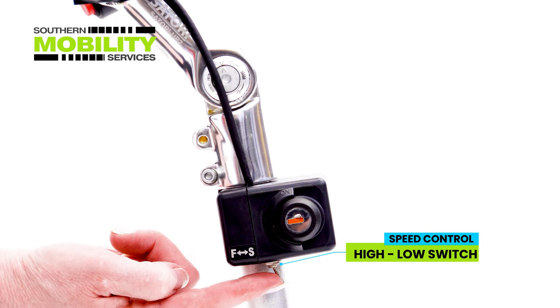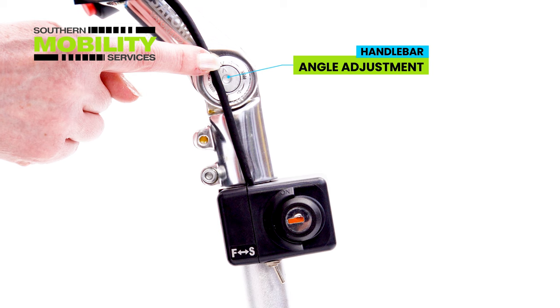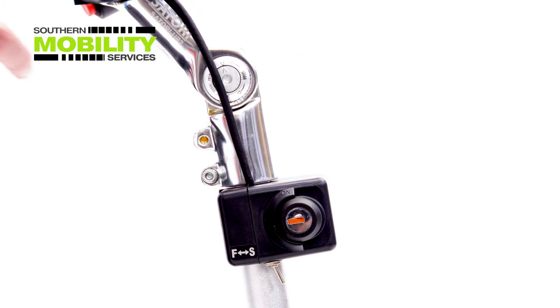There is a fast/slow switch just under the ignition, and more angle adjustment of the handlebars to give the user even more driving comfort.